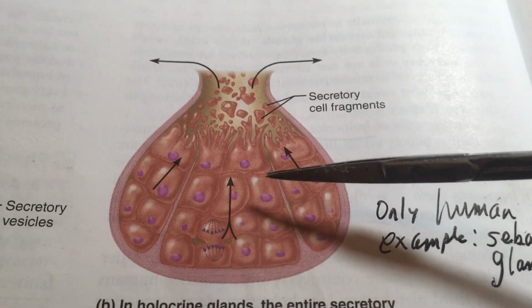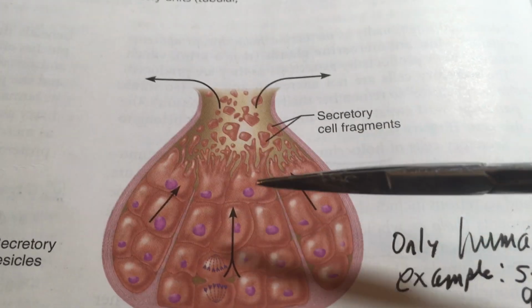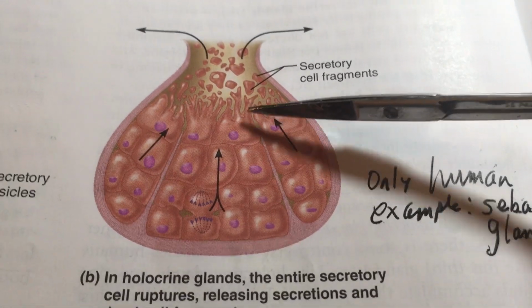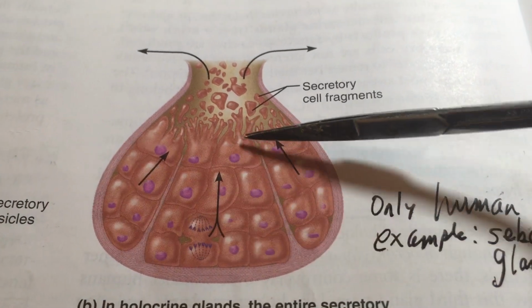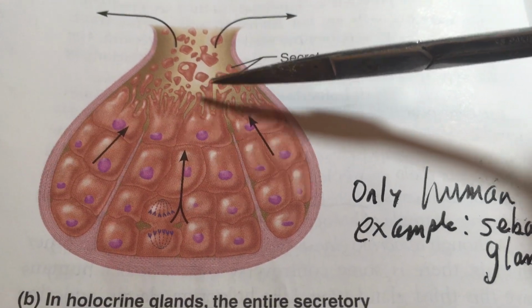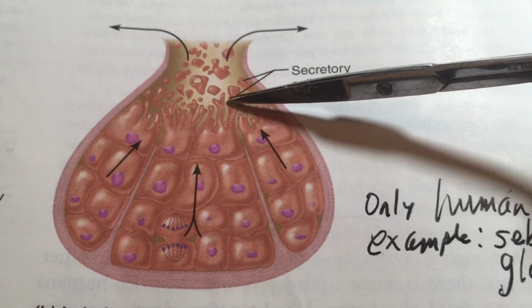And in this case, it's not just the oily product that the cells make, but it's the entire cell that's being released, and hence it's referred to as a holocrine. The whole cell ruptures, okay, and is delivered. In some ways, that's why some of these glands tend to get a little bit stuck with whiteheads and blackheads and so on.